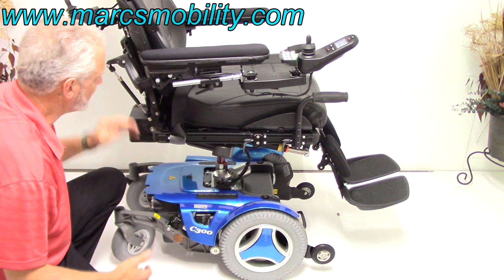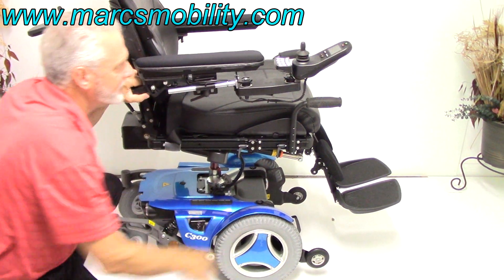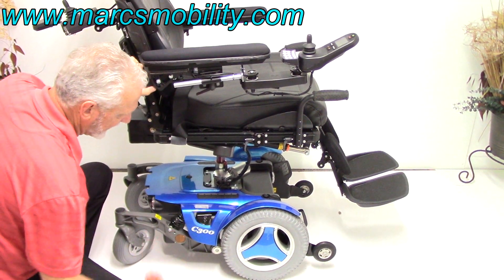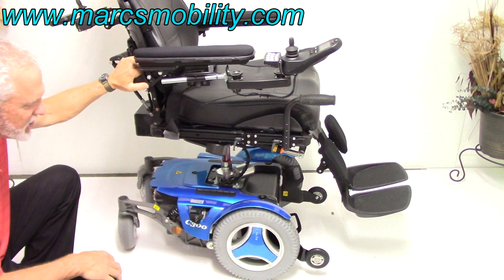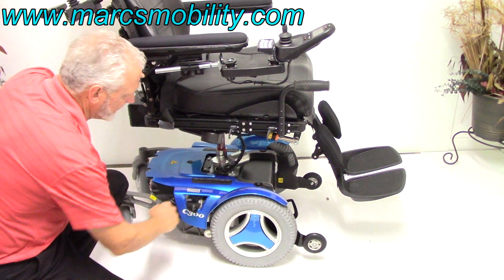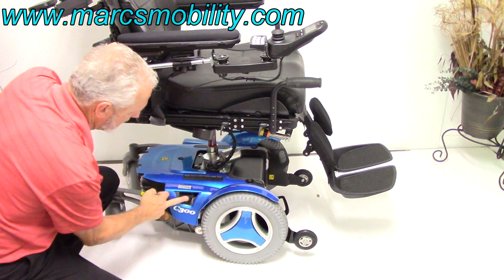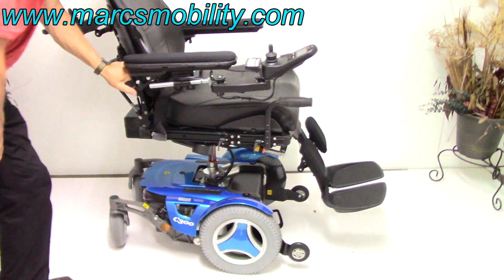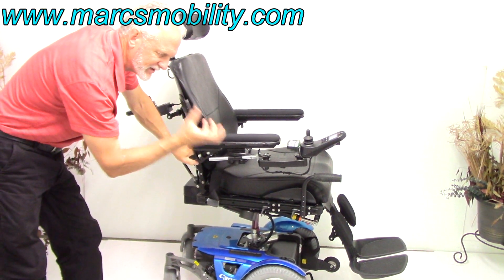If you ever have to push this chair, you can't push it while it's in gear. Turn the power off and there's a lever right here — pull it out and towards you, and now you're in neutral. Remember, this chair weighs 400 pounds so it's not easy to push. By pulling this lever out, you can put both wheels in neutral, because there's a motor for each side. Push it back in and turn the power back on. If you leave the power on when you try to push it in neutral, the electricity in the motor will resist.